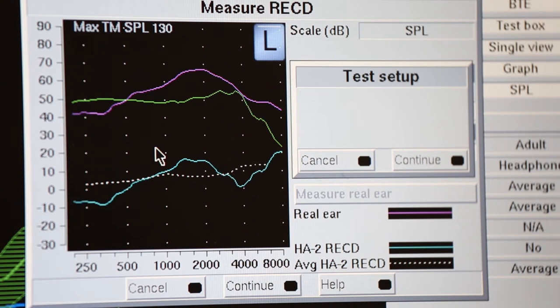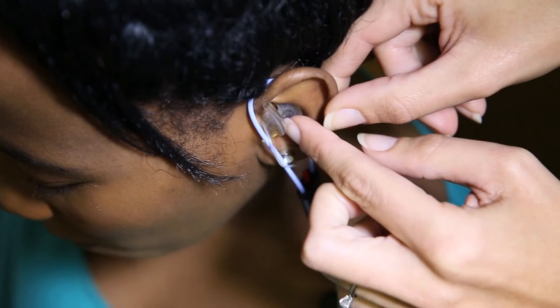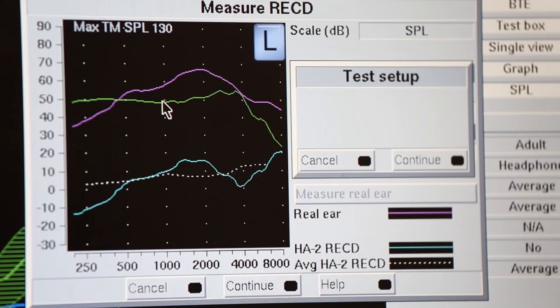Note that the hearing aid is not included in this test as it is not a measure of verification. We play a shh sound through the transducer and this is what we should see. If this line is significantly below the coupler line, we know that there is not a good fit for the mould and we can move the mould like this until we get a better fit.